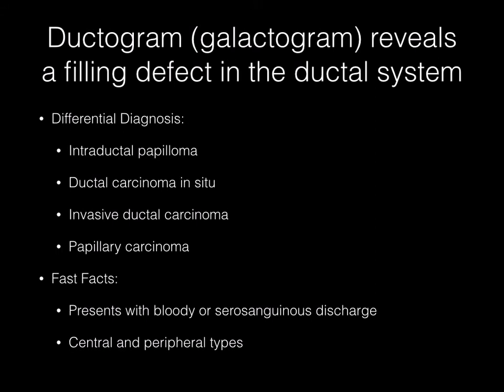This ductogram, also known as a galactogram, reveals a filling defect in the ductal system. The differential diagnosis includes intraductal papilloma, ductal carcinoma in situ, invasive ductal carcinoma, and papillary carcinoma.